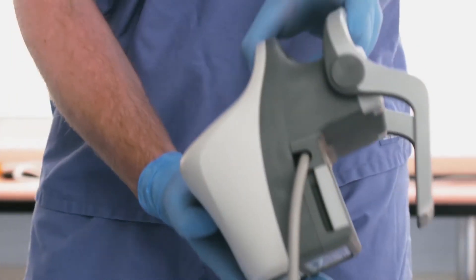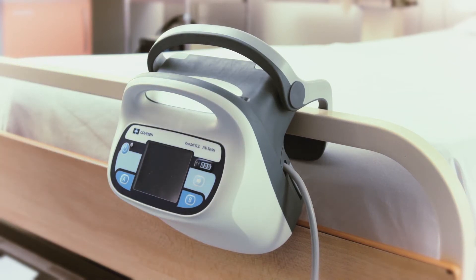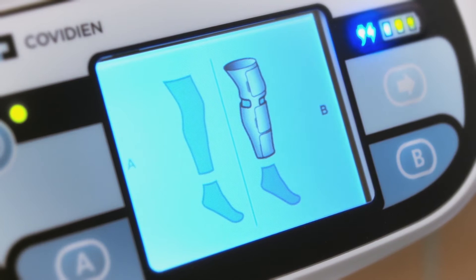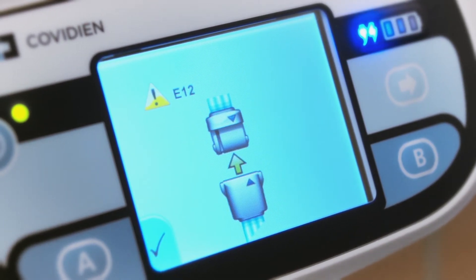The controller has an adjustable bed hook to make attachment to a patient's bed easier and more secure. A graphical user interface allows for an intuitive operation, including animated error code resolution.